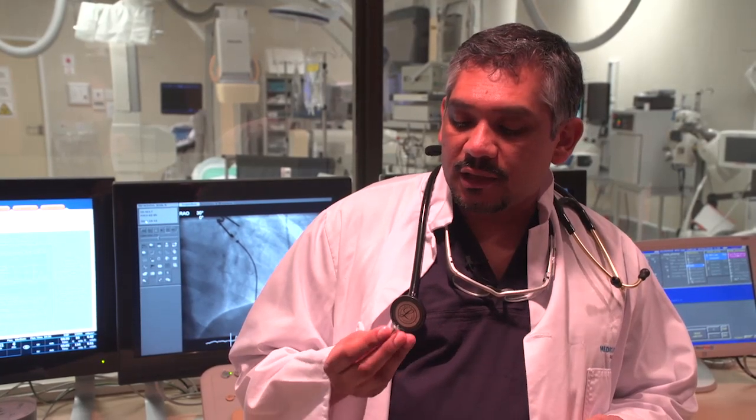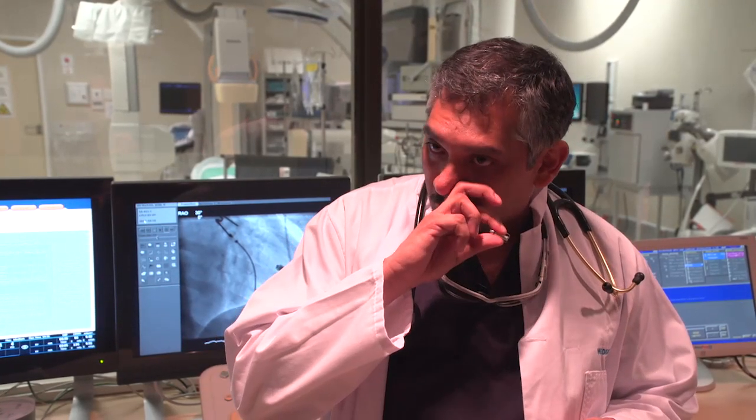The little tiny microchip of a pacemaker is really incredibly sophisticated technology, because it's a battery, it is something which is pacing, it is something which is sensing what the heart is doing, and at the same time it also has a built-in accelerometer, which is really a feather in the cap of the engineers, because you have to think about the fact that this device is attached to a muscle which is moving all the time, yet it is also able to sense the patient's activity and adjust itself according to what the patient is doing.